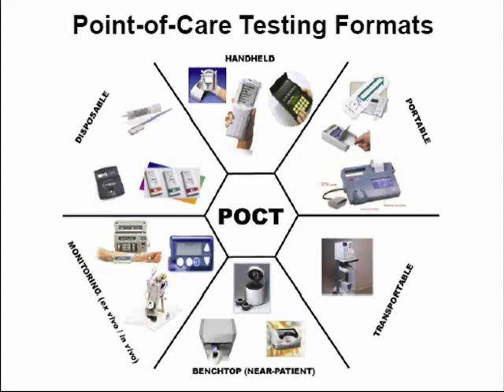Moving on, we have transportable devices. These devices are rather large, therefore they are not capable of being transported by a single person. Therefore, they are usually wheeled around on a cart, as shown in this picture. This instrument here is a large whole blood analyzer called the PHOX, by Nova Biomedical. Oftentimes these are used in satellite laboratories as well as operating rooms as needed.